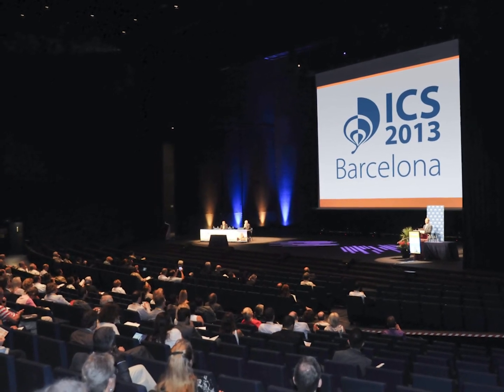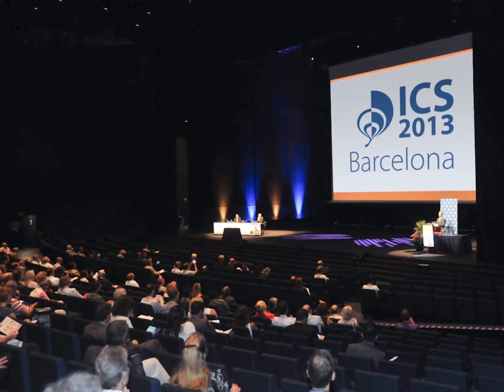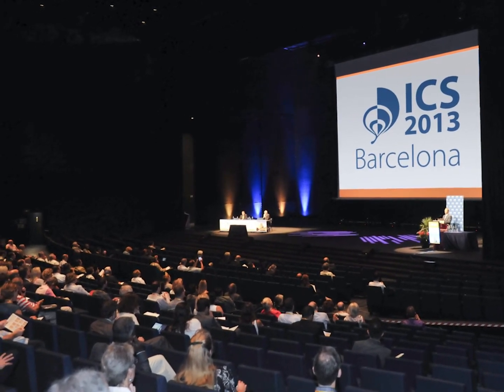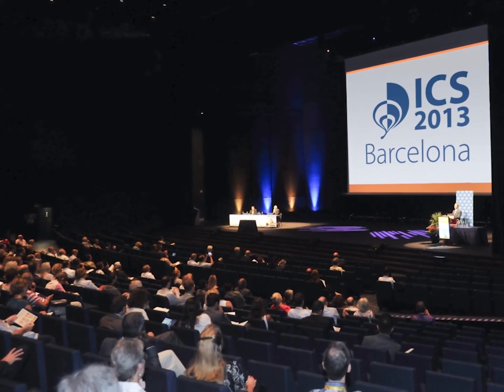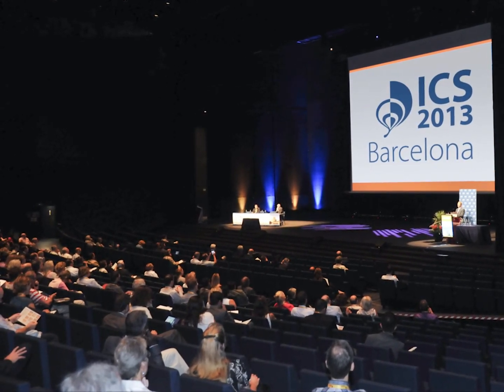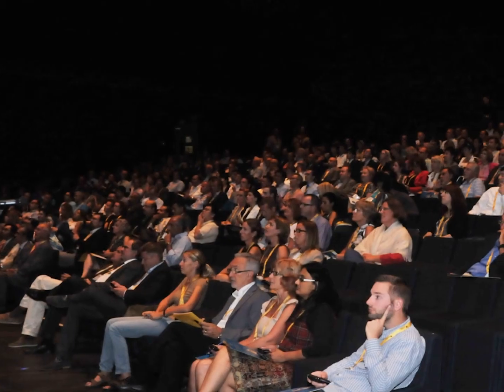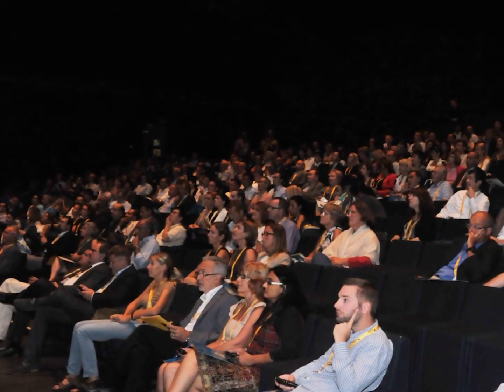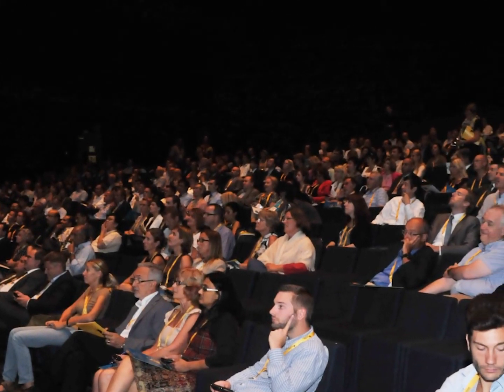So I think I hear a question. We call the reference slice the point of minimal dimension. It's at the level where the pubic symphysis comes together. And the 3 central slices are 2.5 millimeters above that, and another one is above that, so it's cranial to the reference slice. I'm not sure if that answers the question, but maybe we can talk after.